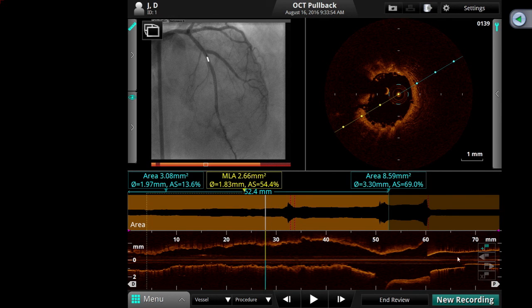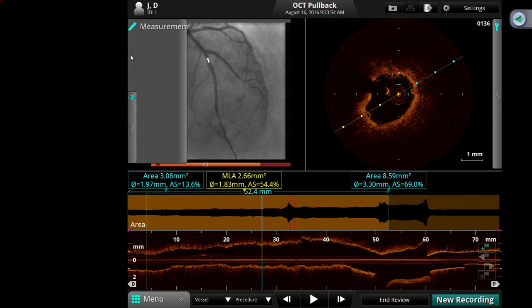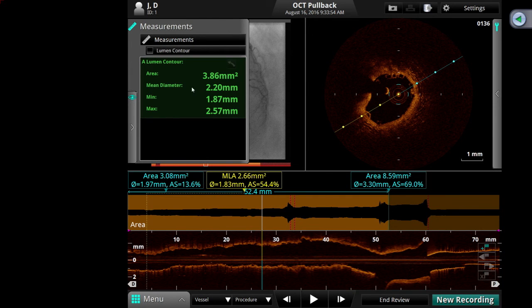Okay, right here. This is where we thought angiographically it was not expanded, although it's a very good lumen. Now, what is the lumen cross-sectional area there? You see here the MLA at 10 and 11 o'clock position. It's less than 4. Oh, 3.86. Good. But that's less. You expected at least 4.0. Yeah. Reference is small.